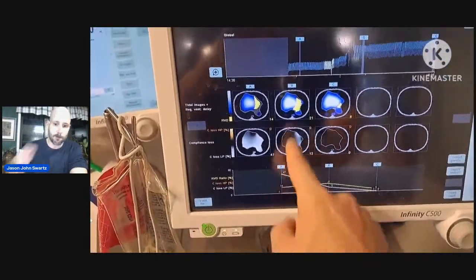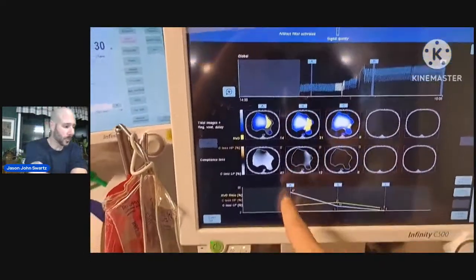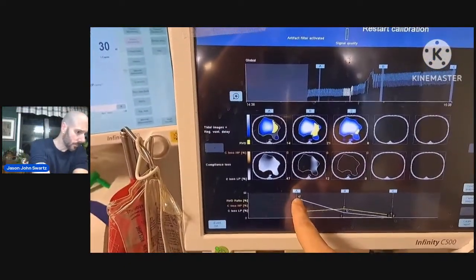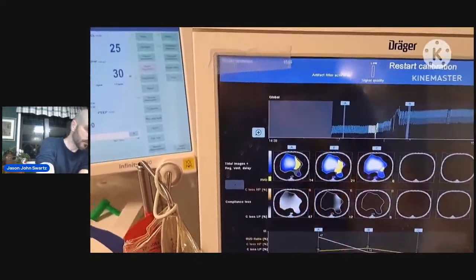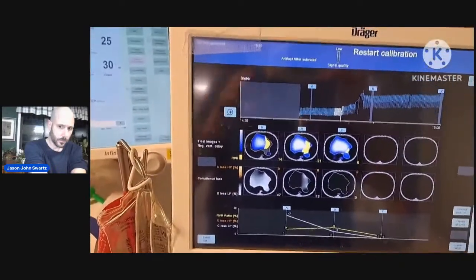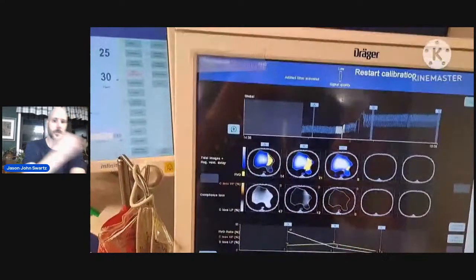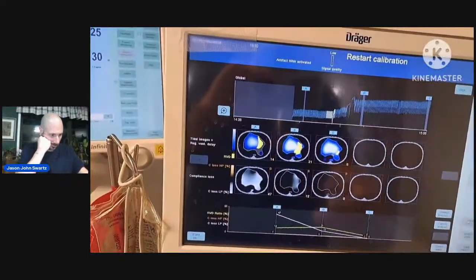When the patient was on conventional mode over here, there was a 47% compliance loss. All this white means that the compliance is really bad, and that the lung is at risk of atelectasis, lung collapse, and indeed that is what was occurring. So everything is making sense clinically. The results, just don't blindly believe them, but this is what we would expect.